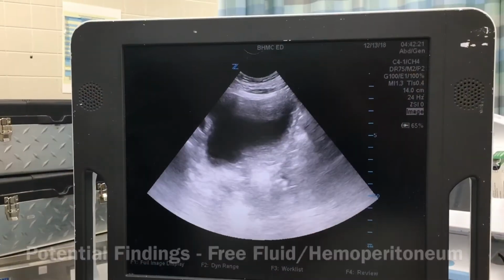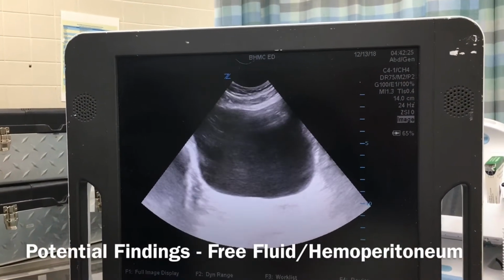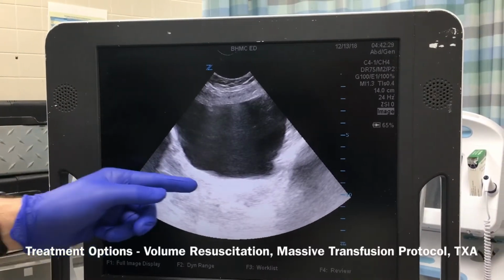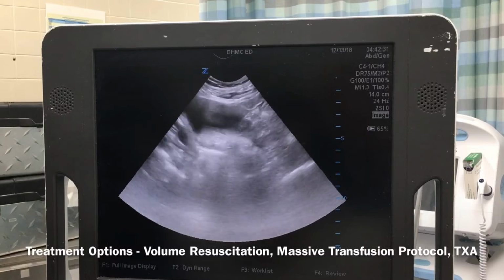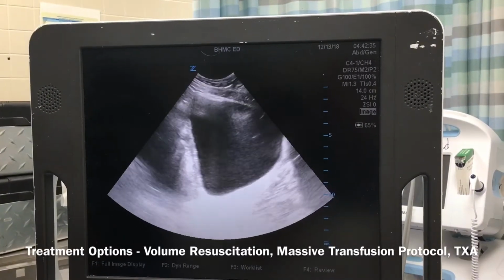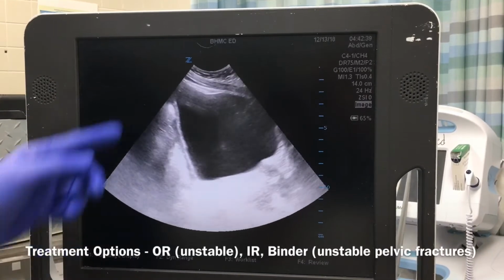In the pelvis view, again, you want to look directly above the pubic symphysis and aim downwards, looking for the bladder. You want to scan all the way through looking for free fluid behind the bladder in two planes. Turn 90 degrees, make sure your bladder's in view, and scan from side to side, again looking for free fluid.